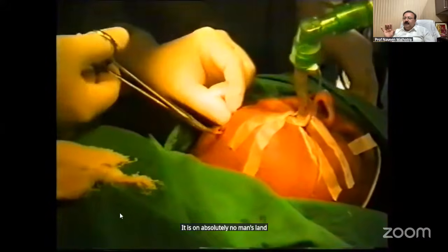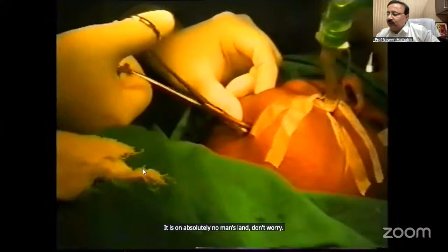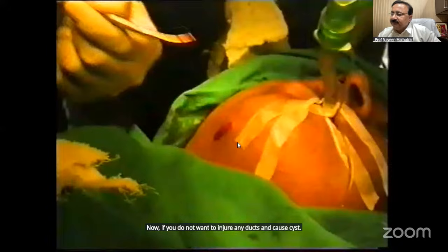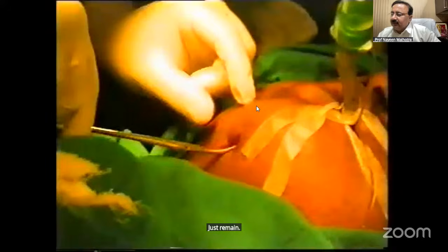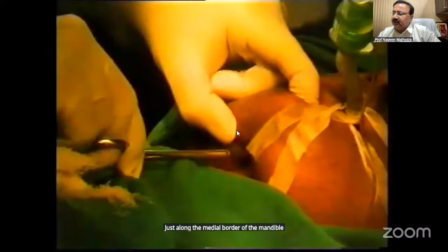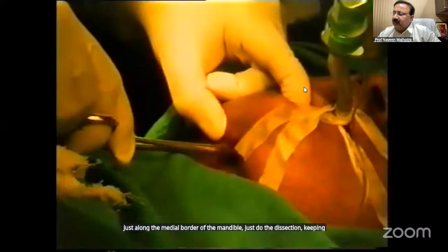It is an absolutely no man's land, don't worry. Now, if you don't want to injure any ducts and cause a cyst, just remain along the medial border of the mandible. Just do the dissection, keeping, so I'm putting my counter here.